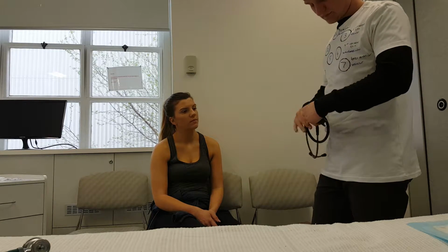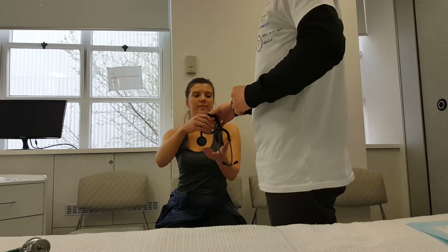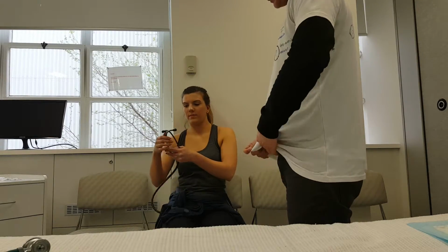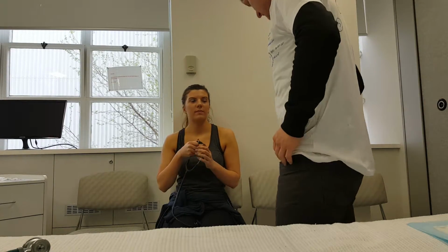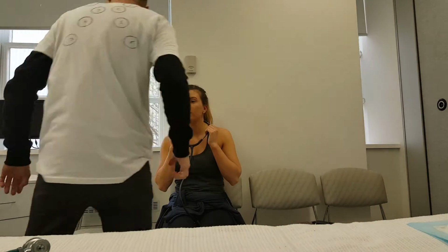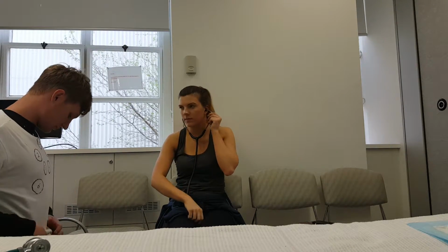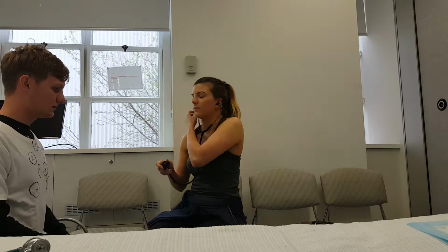So we'll have a go at that. Okay, so if you wanted to take this one, this was a bit nicer. So for now we won't expose the patient. You could just use me as an example, and we will just do the front chest sounds. So you'll be listening across all of the locations there.